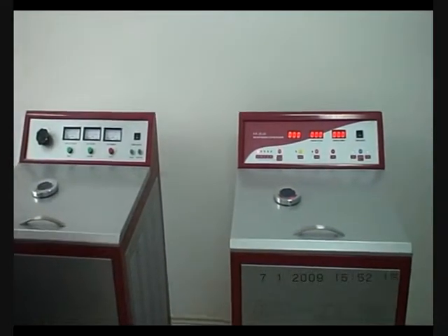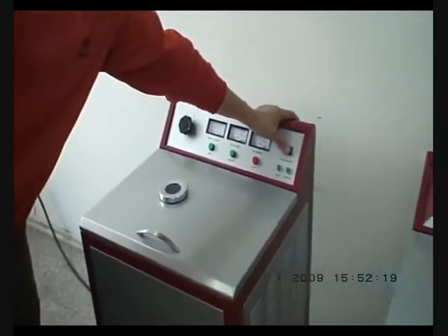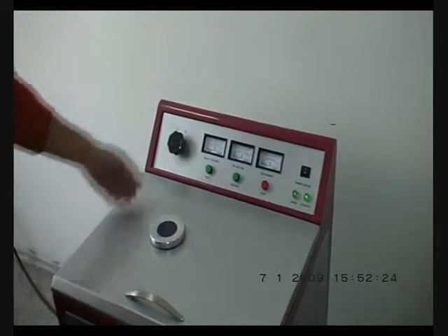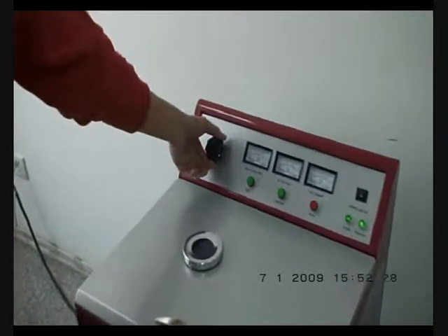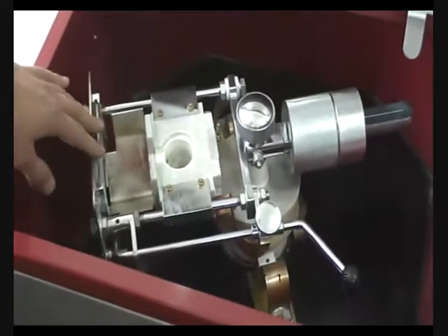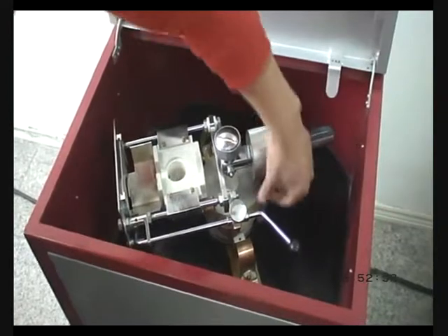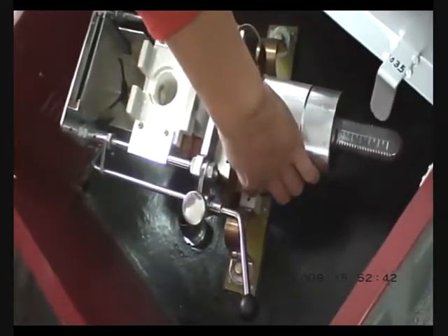Now I will show you how to test the machine. First, turn on the switch. The test stage is zero — turn to zero. Open the lid, and do not put in crucibles. As you can see, there is a red line here. The red line must be above the red dot.